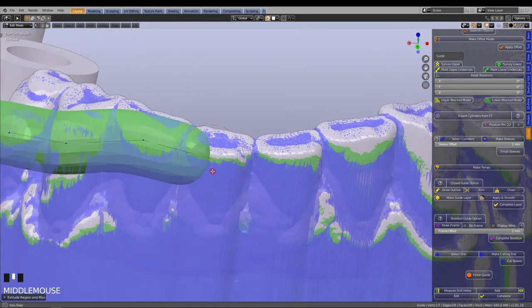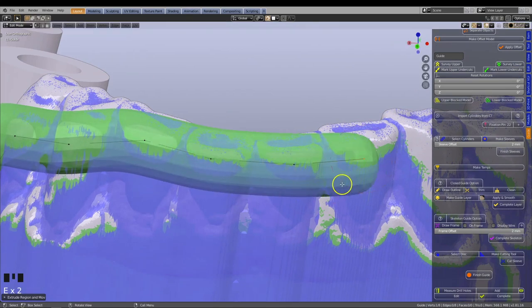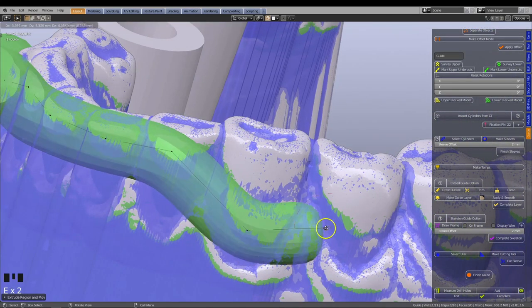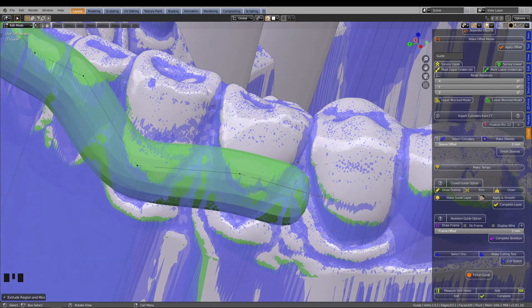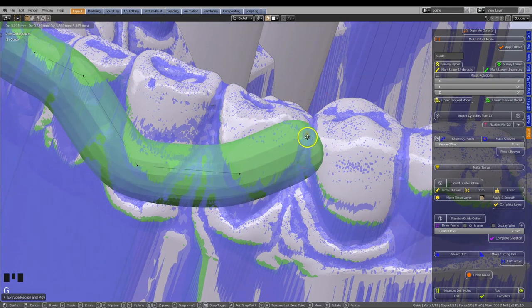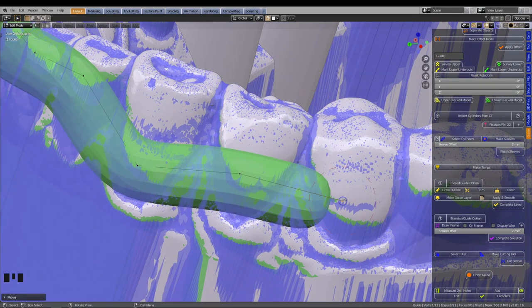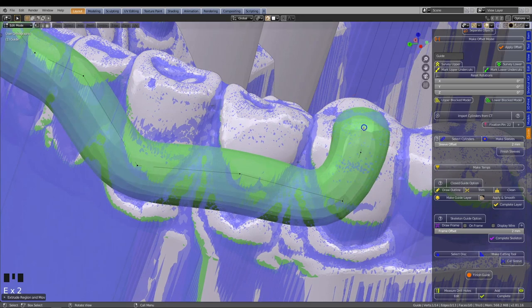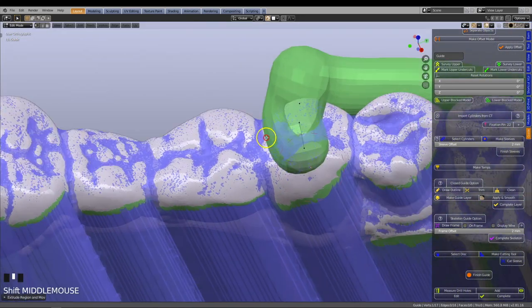As you have learned in the previous tutorial, we do not advise traveling through the interproximal embrasure area of the teeth when looping the frame back into the other direction. It is better to move up and directly over the midline of the tooth.